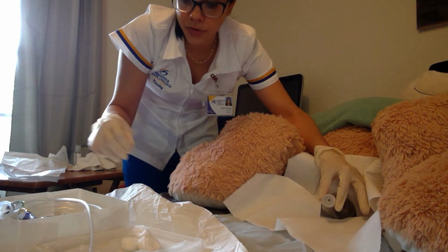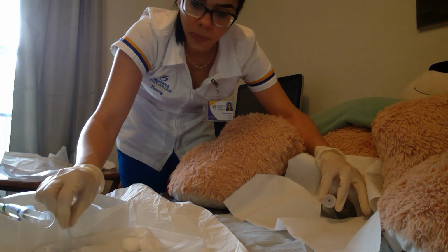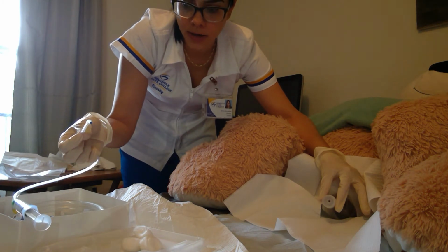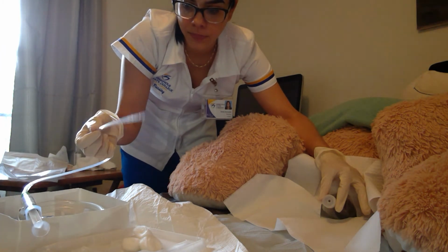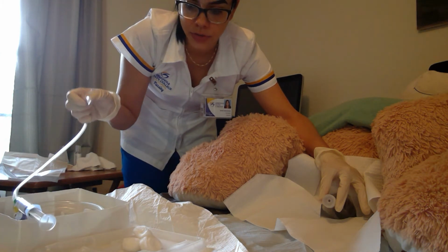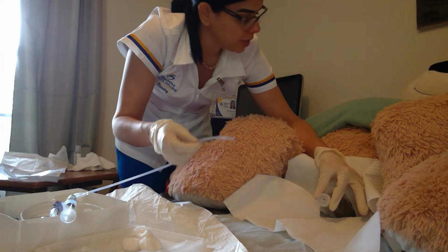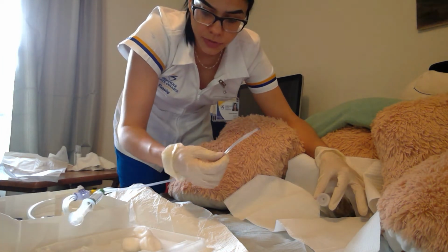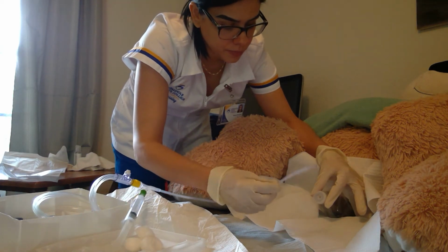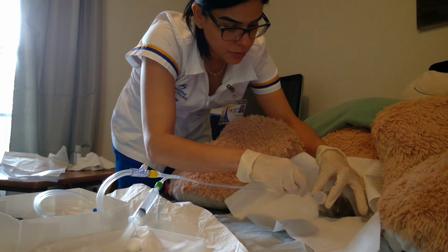So now what I'm going to do is I'm going to take the tip of my Foley catheter, about 3 to 4 inches, and I am going to insert it. Okay, so deep breath, Miss Velilowski, bear down, and we're going to go in, just making sure that she knows that we're about to go. Okay, and there we go.